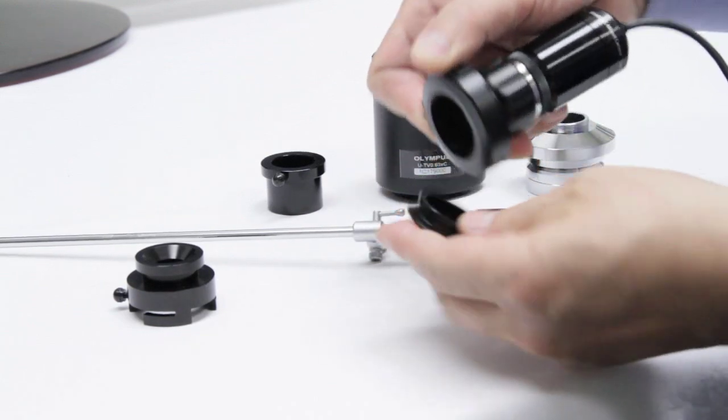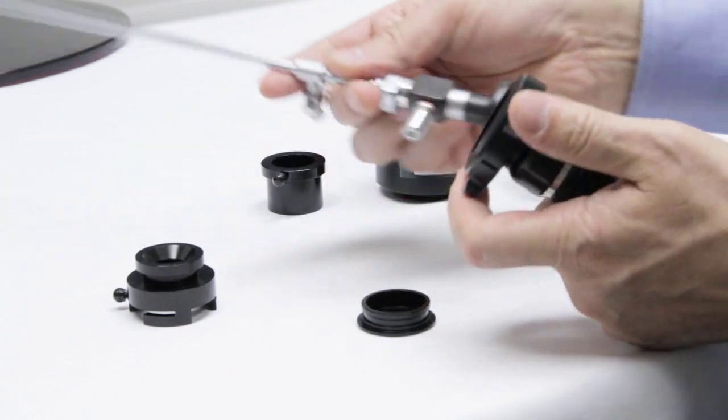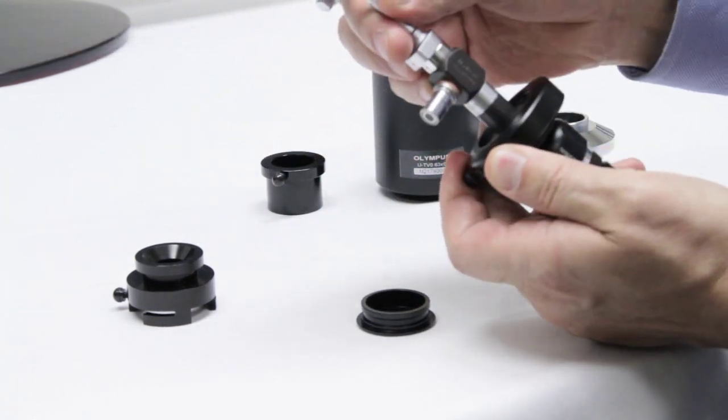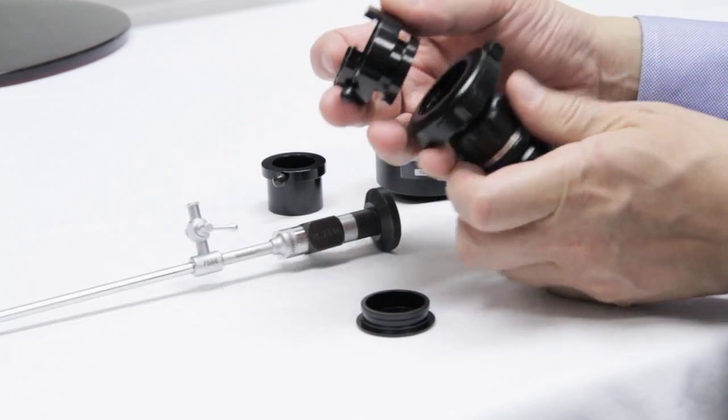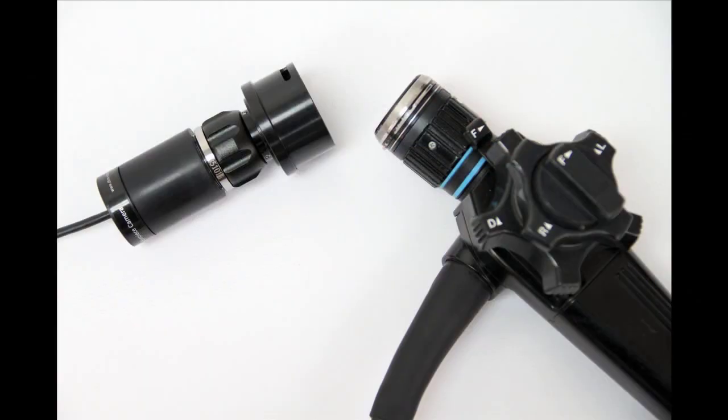So we will release the cover from the adapter and connect the rigid scope in place. If you need a flexible scope, there is a different Olympus or Pentax adapter for that.